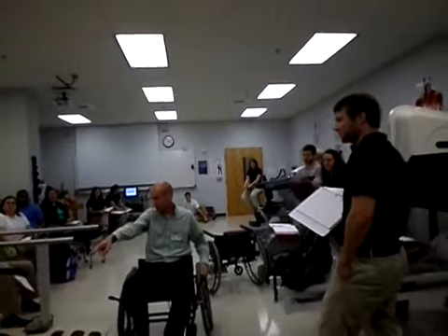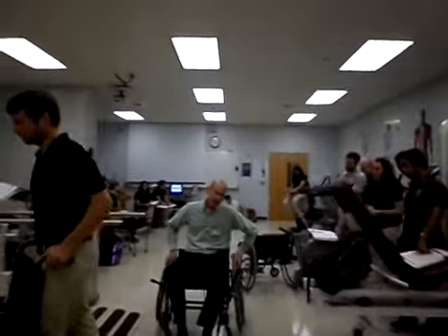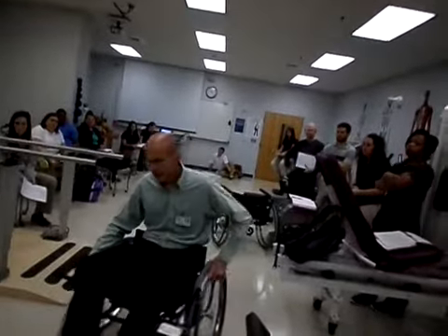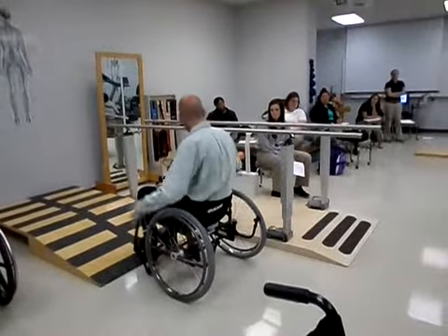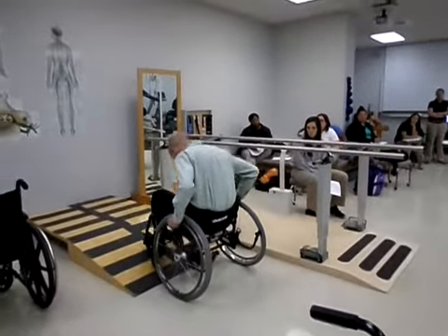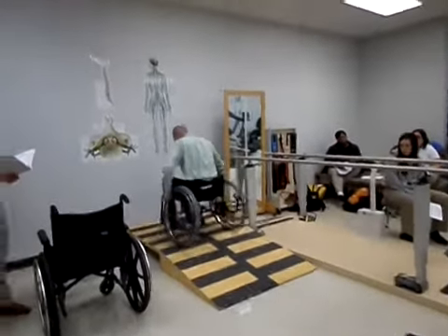Josh, will you move this wheelchair around the way, please? Going up and down the ramp, please be very, very, very careful with this. This is where students are constantly falling backwards. So you really should have a spotter when you do this. So when you go up the curb, again, try not to bang on the curb, but do a wheelie and then let yourself down that way. And then you got to really lean forward as you push up the curb.